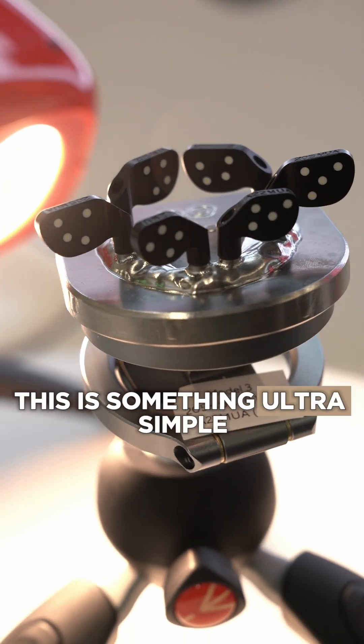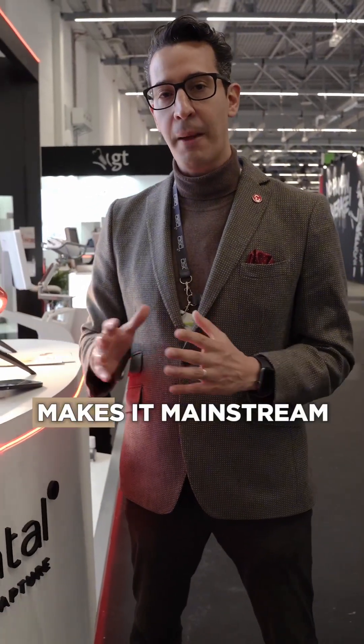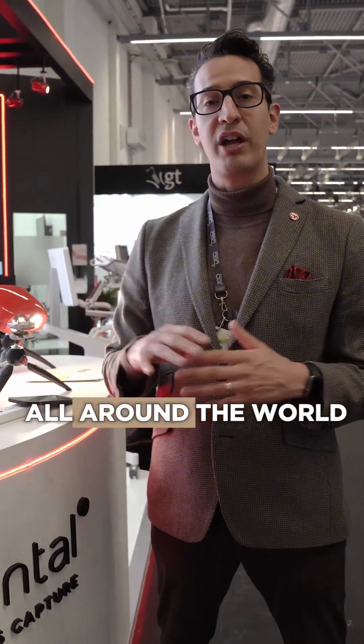This is something ultra simple, ultra affordable, bringing high quality and precision, making it mainstream, and making it accessible and affordable for dentists all around the world.